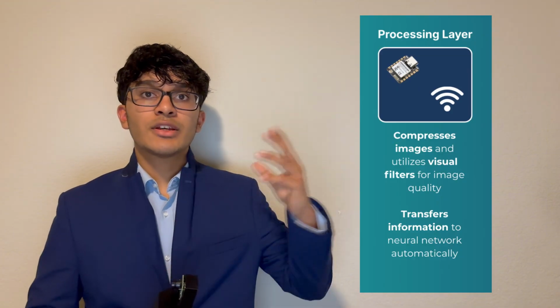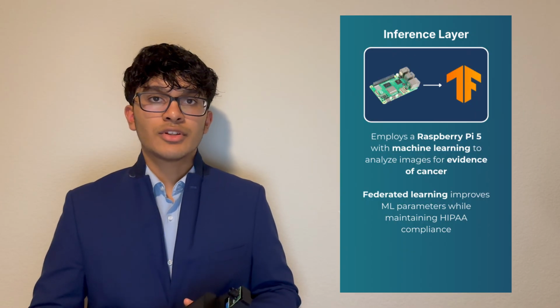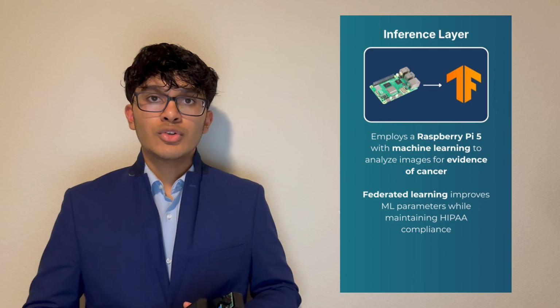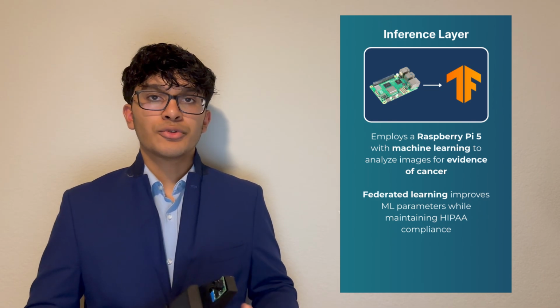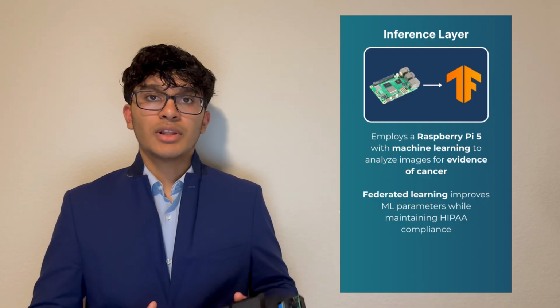Next, these images are sent to the processing layer where a microcontroller compresses and filters them based on quality. These images are then sent over using Wi-Fi or USB based on the physician's needs to the inference layer, where a Raspberry Pi 5 mini computer analyzes the images using a federated neural network that is trained to detect oral cancers visually. This model is different from others because it maintains HIPAA compliancy.